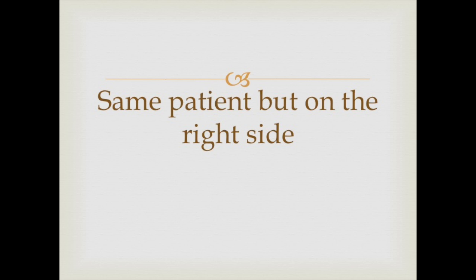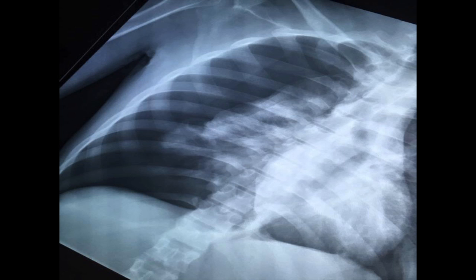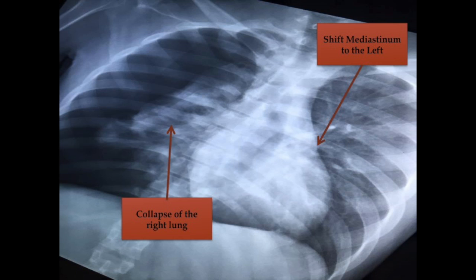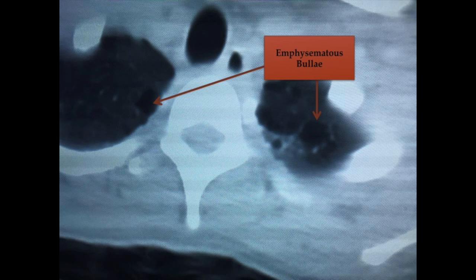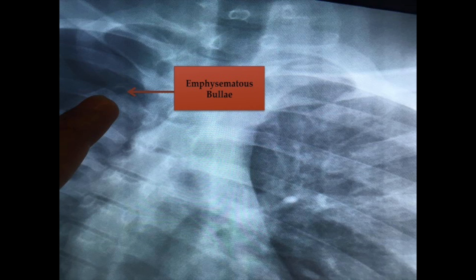Now we show the same patient who developed another tension pneumothorax but on the right side. In this finding, you see the mediastinum shifted to the left side and collapse of the right lung. The question is why did he develop another tension pneumothorax on the right side? On CT scan, it was found he had multiple emphysematous bullae on both sides of the lung. In this chest x-ray, I have pointed at the emphysematous bullae.